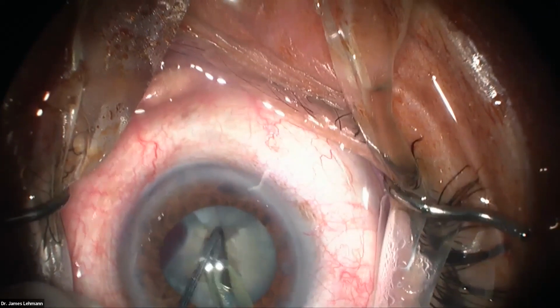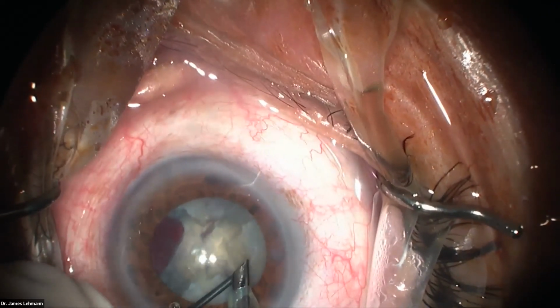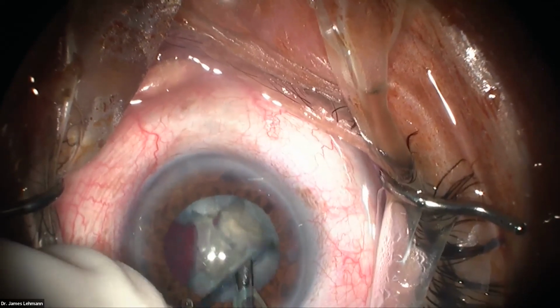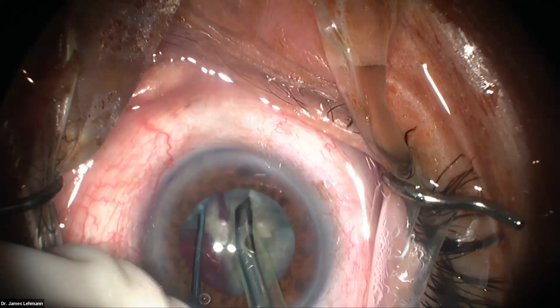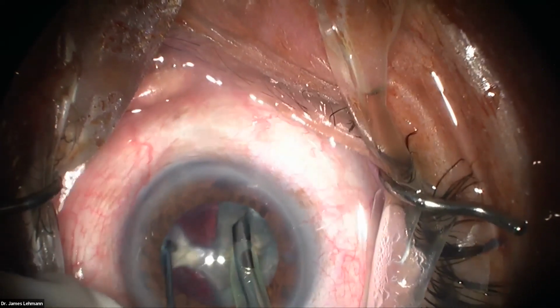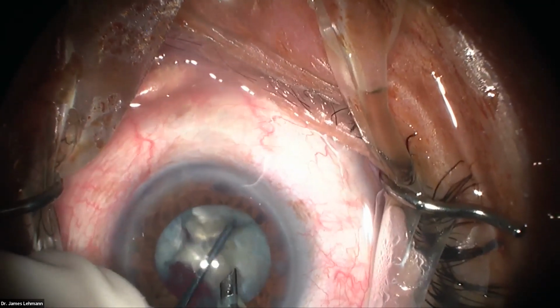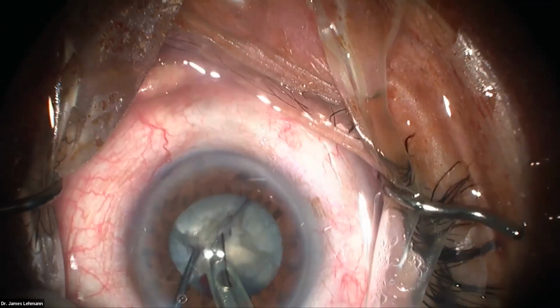It still looks like it's attached a little bit. So instead of trying to do an awkward movement like this, I'm going to move it where it's directly across from me. And now I can put the phaco tip all the way into the groove and just break it a little bit more apart. So that one's still stuck. I'll try this piece. That looks better. So I'll take this one out.